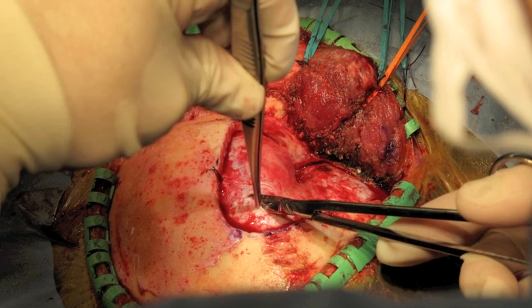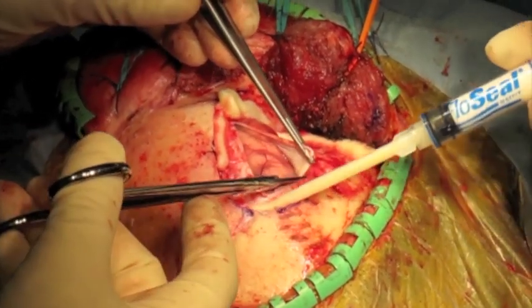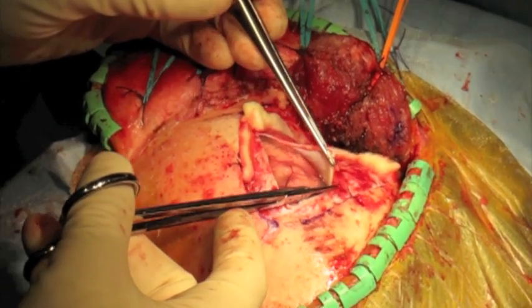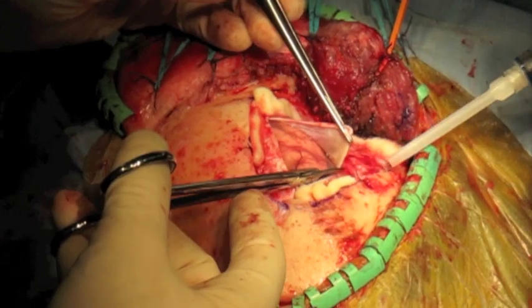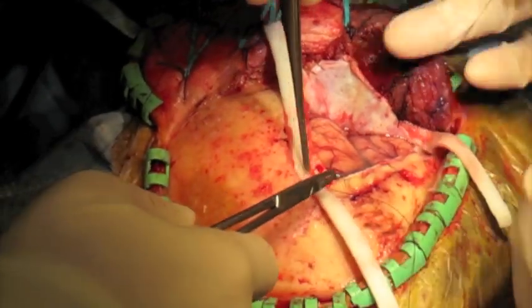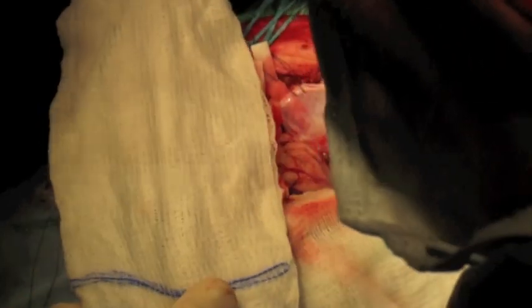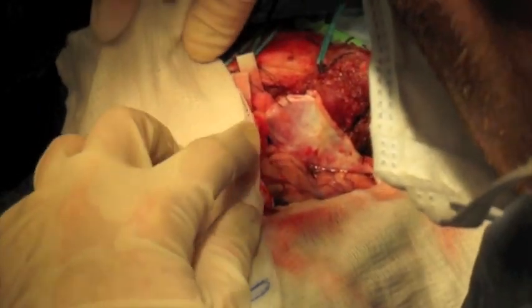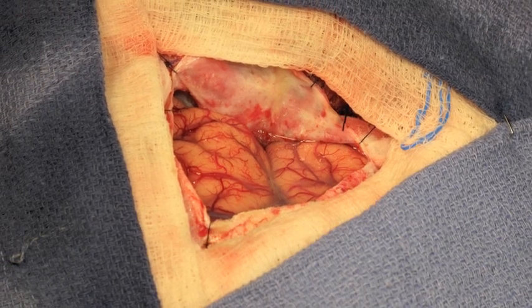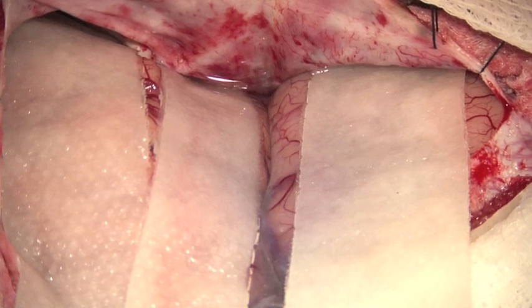The dura is opened posteriorly using a 4-0 silk suture and number 11 blade, and this opening is then extended across the sylvian fissure with long straight scissors cautiously so as to not injure the cortical surface or vasculature. The dural edges are tented over cottonoids to maintain a dry operative field. Wet sponges and towels are placed at the edges of the surgical domain, the Greenberg retractor system is assembled, and Telfa is placed on both sides of the sylvian fissure prior to bringing in the operative microscope.